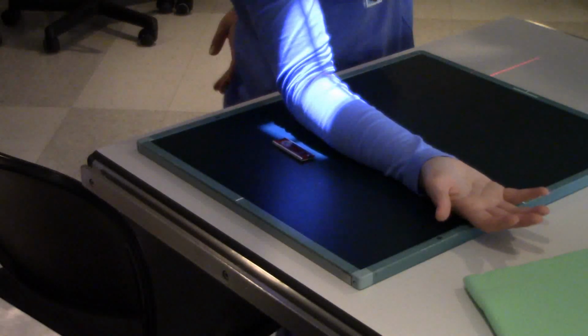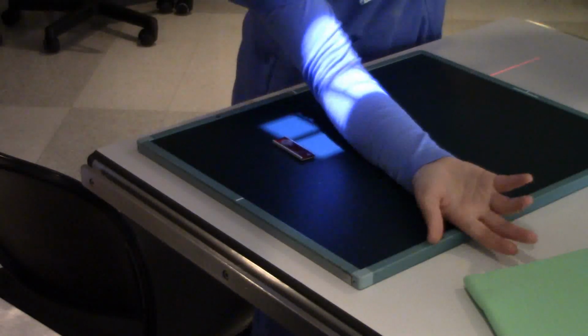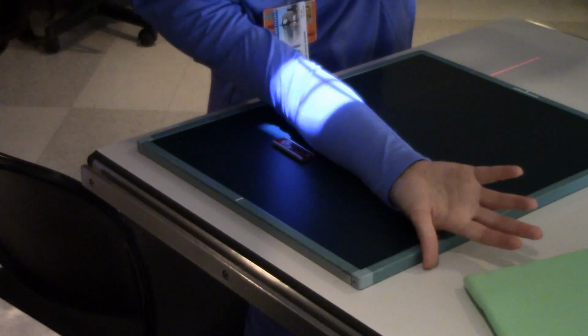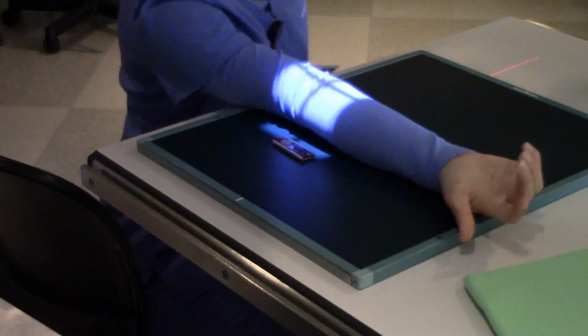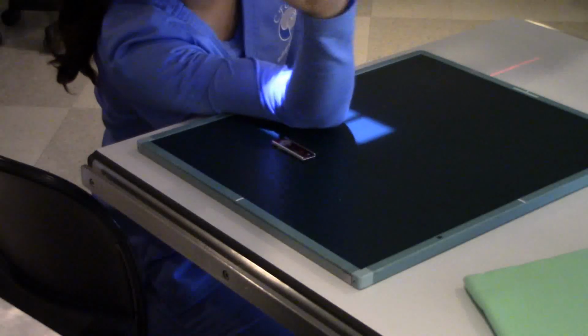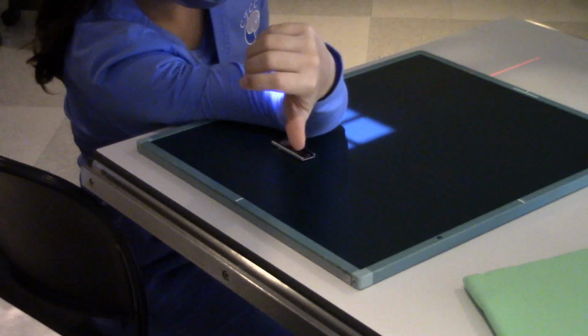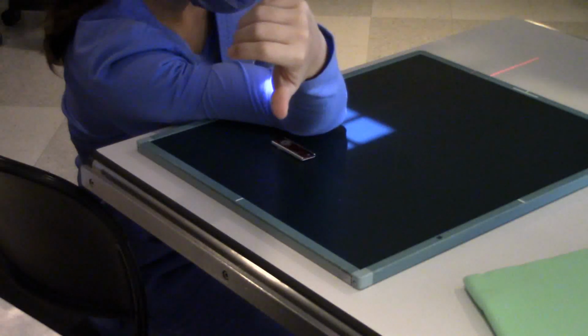But for the trauma external oblique, you're going to try to roll your patient external. Okay, ma'am, can you roll? Oh my goodness, oh that hurts. Oh, she's cured. She's able to straighten her arm out. It's like a miracle. There you go, that's better.